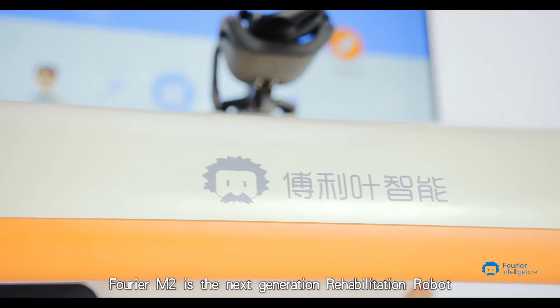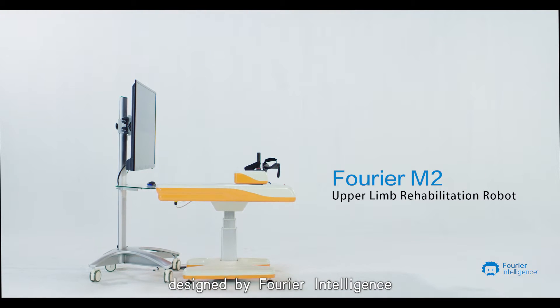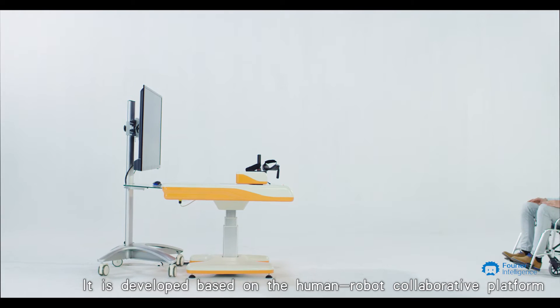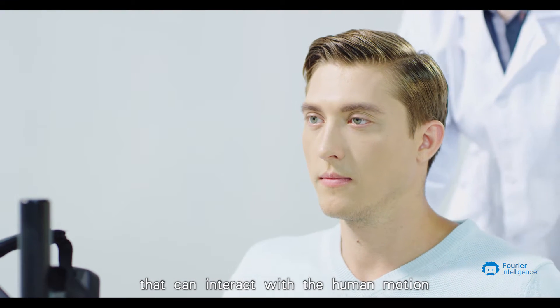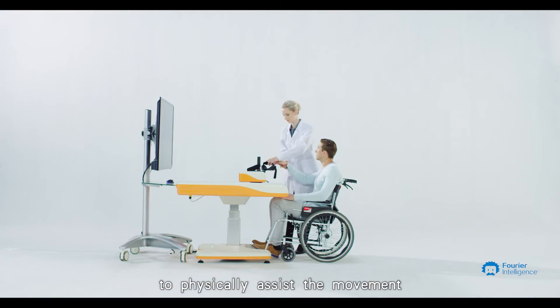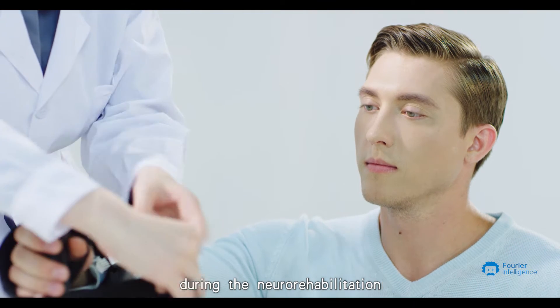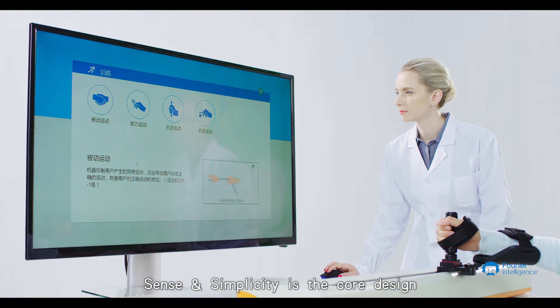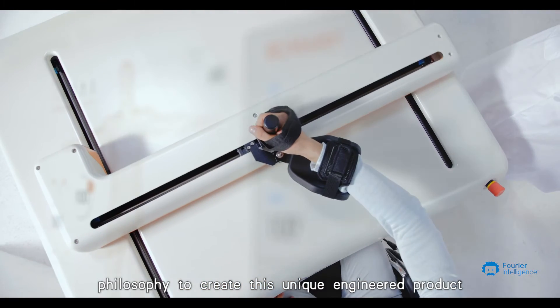Fourier M2 is the next generation rehabilitation robot designed by Fourier Intelligence. It is developed based on the human-robot collaborative platform that can interact with human motion to physically assist movement, accurately measure performance, and precisely control training during neuro-rehabilitation. Sense and simplicity is the core design philosophy to create this unique engineered product.